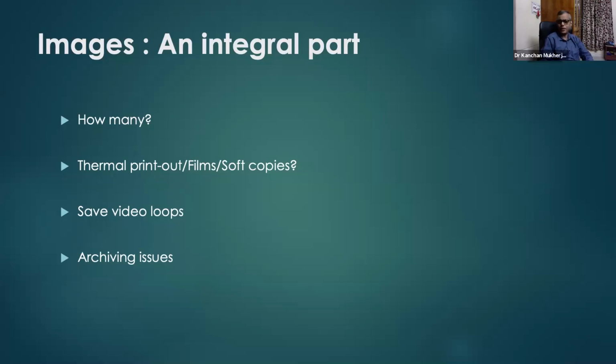If there are findings, I suggest you save video loops on your machine so that you can refer to those at a later date. Now comes the issue of archiving. If you are saving too many videos, your machine will hang one day. So save video loops, save as many images as possible in your machine so you can defend yourself at a later date. But then you need to take backups from time to time, so in case the machine is replaced one day, you will not lose your data.